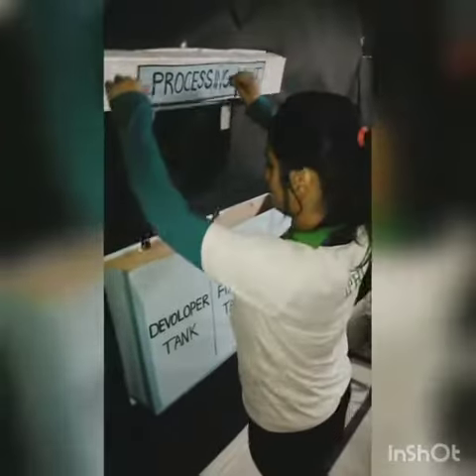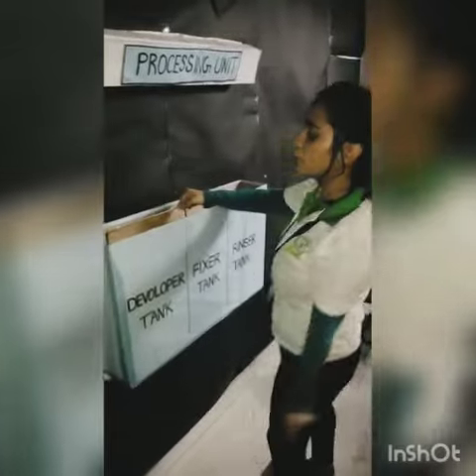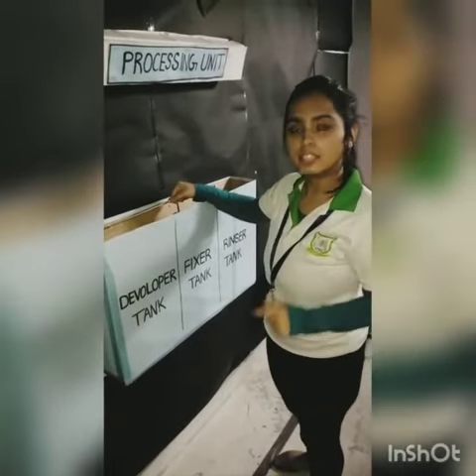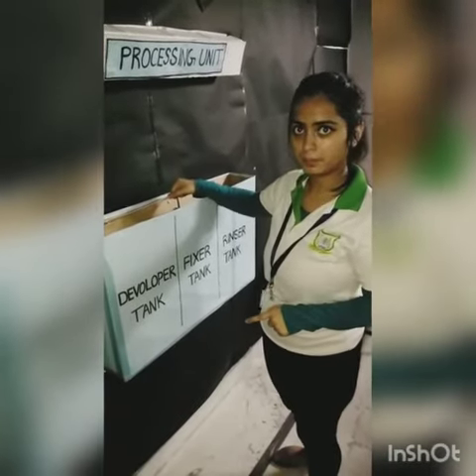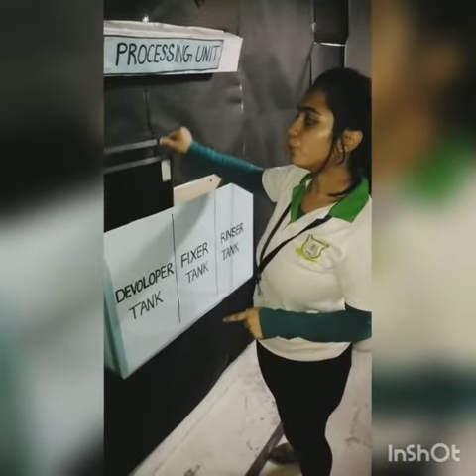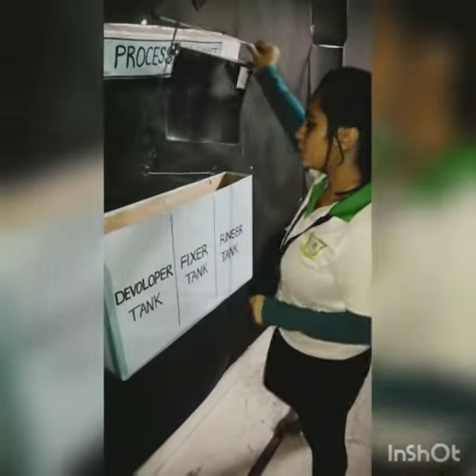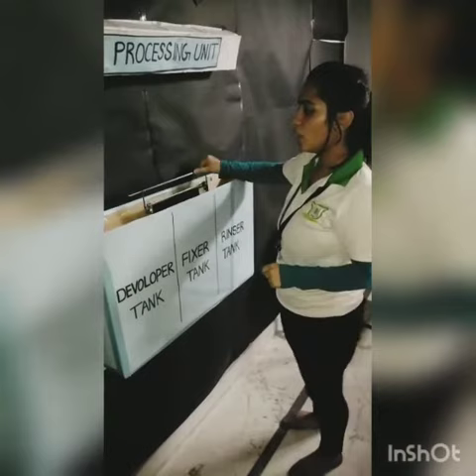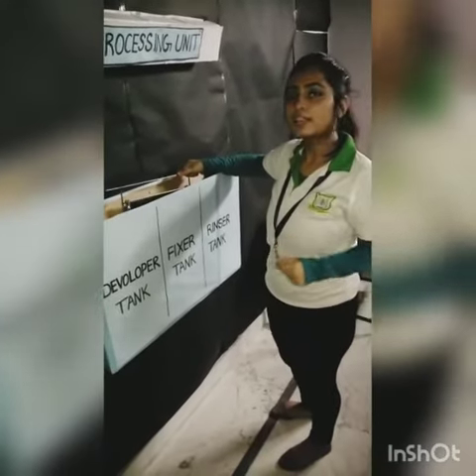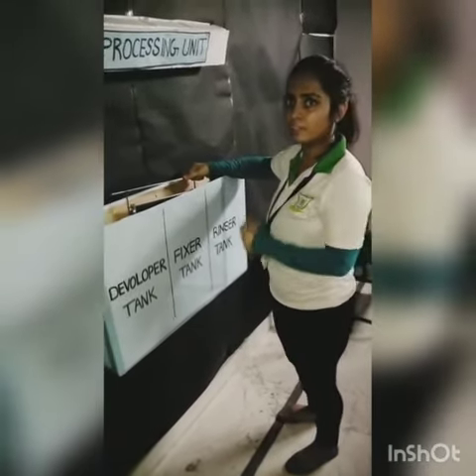Now I will show you how to develop a film. First, the film should be hung in the hanger like this. Then you dip this film in the developer tank for a few minutes, where the latent image formation occurs. Remove your film from the developer tank and then dip it into the fixer tank, where the hardening of gelatin occurs and the AgBr crystals fix on the film.